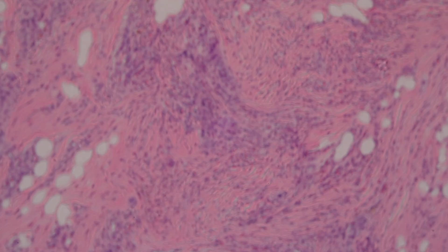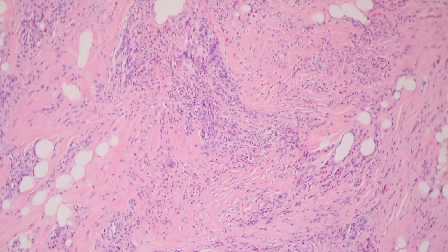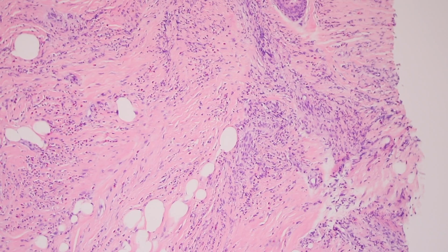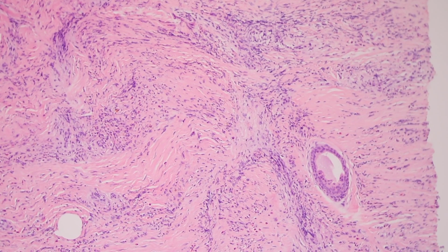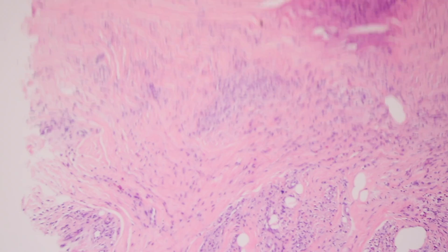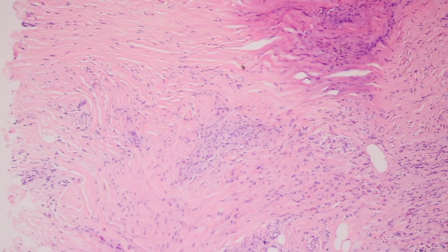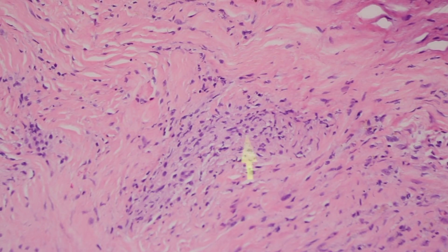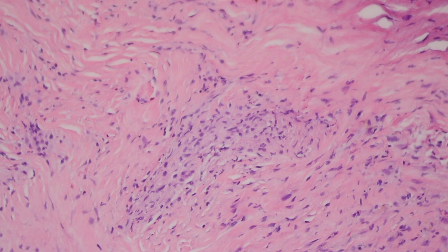So in the primary process, my understanding is that you still have a neutrophilic vasculitis, but it leads to so much sclerosis and fibrosis that swirls around it that the vessels that are actually damaged get really trapped, and it's hard to see them. I'm trying to find some good areas. Like here, it's hard to even see that there used to be a little vessel in here, and it's swirled and wrapped around by fibrosis, and then the background is totally dense sclerotic collagen.